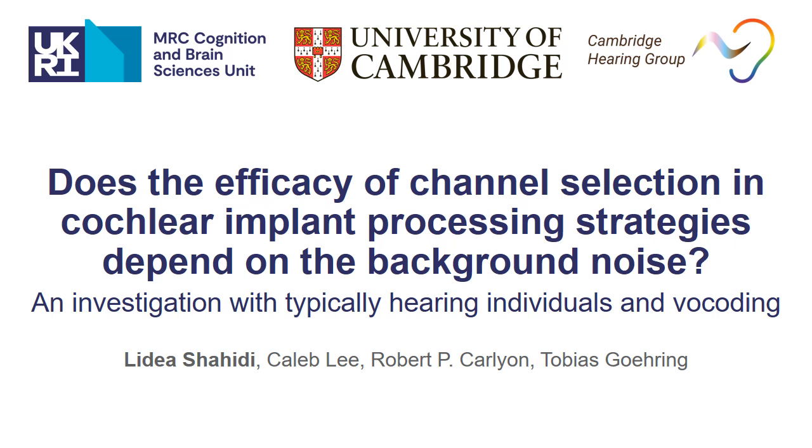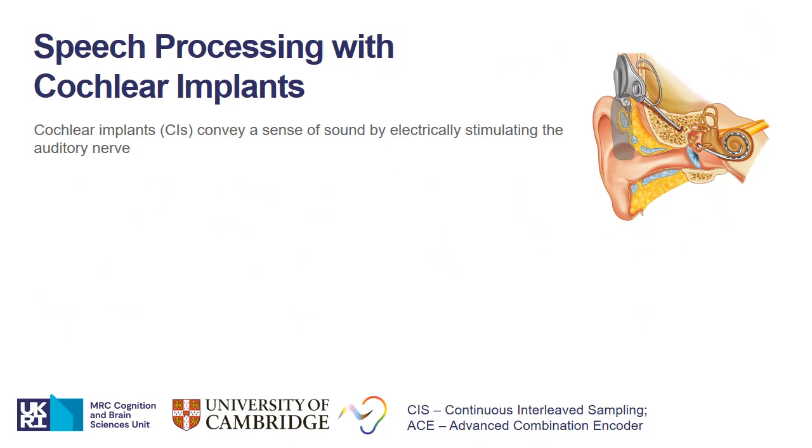Today I'll present two experiments in which we investigate the effect of channel selection in different cochlear implant processing strategies on speech intelligibility. Cochlear implants electrically stimulate the auditory nerve, resulting in the perception of sound.